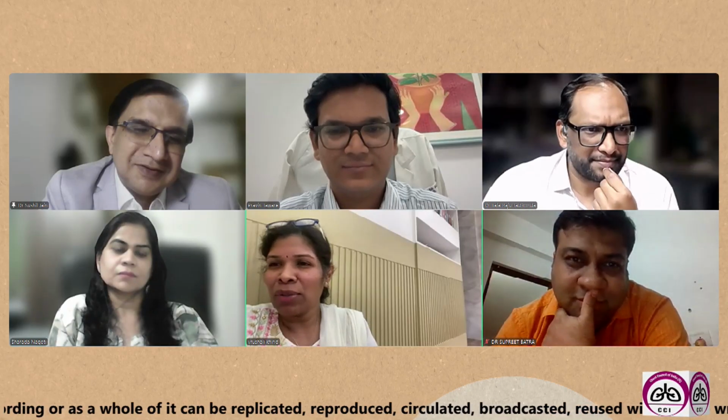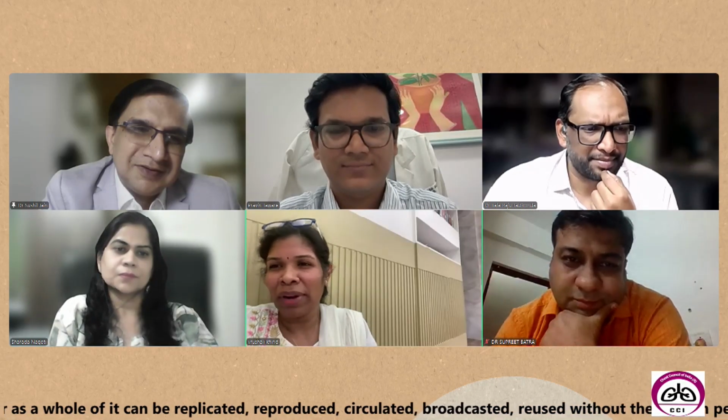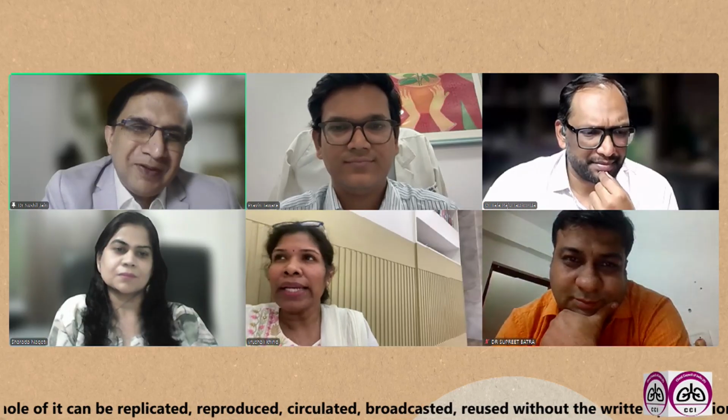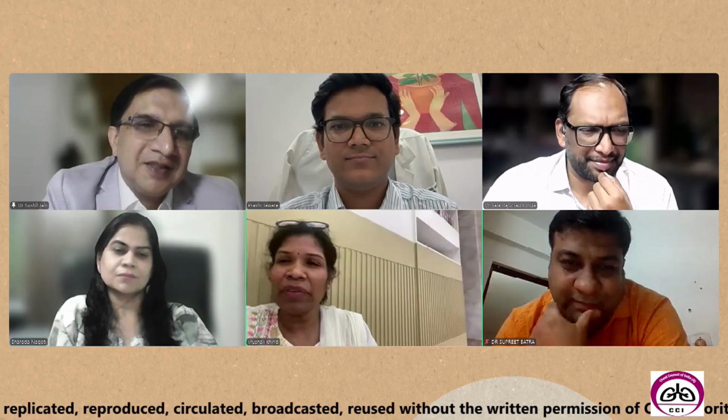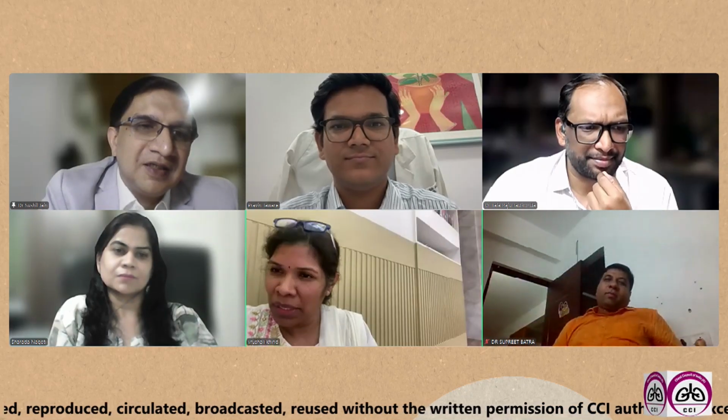The imaging is all right. The indication is all right. The nodal station is all right. So currently nothing. But what we have done is, initially we used to make a lot of slides and waste material on that. So now we make only a single slide and ensure that most of the material goes, if you have a pre-test probability of malignancy, into the formalin, and otherwise into the saline.